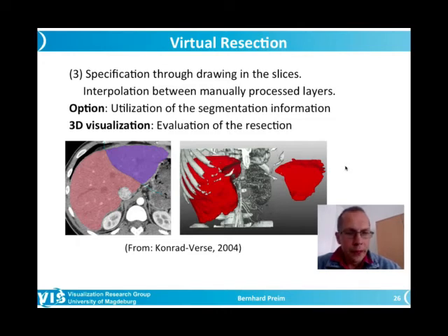Yeah, we did this, in fact, in our work, in particular for defining living-related liver transplants. That means when the liver is split in two halves, it's the liver of a living patient, and there is a donor and a recipient. The recipient has an end-stage liver disease like cirrhosis. The donor is typically a close relative, for example, the son of the recipient, which increases the chance considerably that the organs fit genetically well enough to each other. The blood group must fit, and so on.